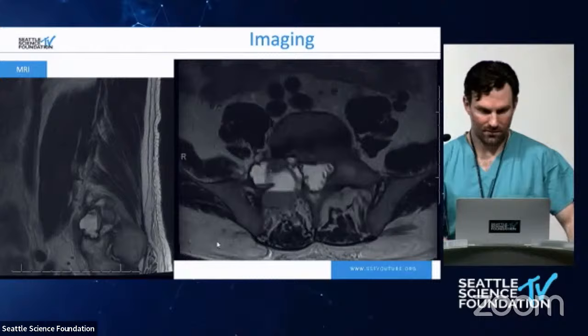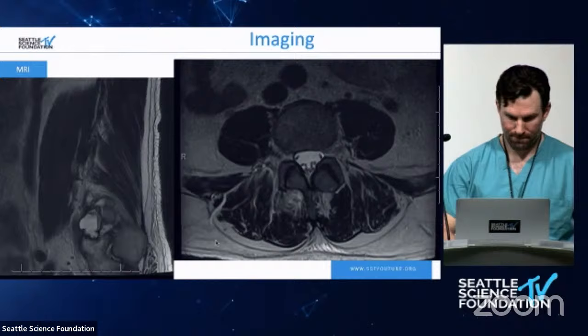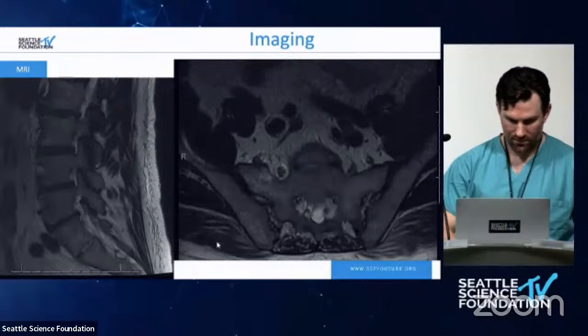So should we biopsy this? And if so, what are the problems with a biopsy to make this actually meaningful? Because it's no problem getting a needle into the cyst, but is that a meaningful specimen that you get from there?